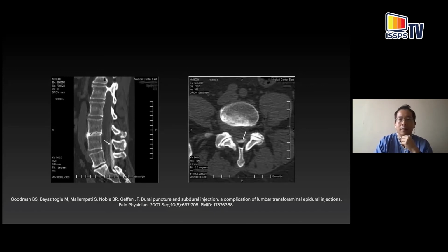It does not even have to be dependent, because as Dr. Miguel has shown us, the subdural space is not a complete space, and it's just a rent between the dura and the arachnoid, which results in a potential space which can be filled by this contrast fluid. In a successful epidural injection, you can see the fluid within the epidural space. Here, it's clearly deep to the fat of the epidural space. It's somewhere deeper in, so it has to be subdural in location.